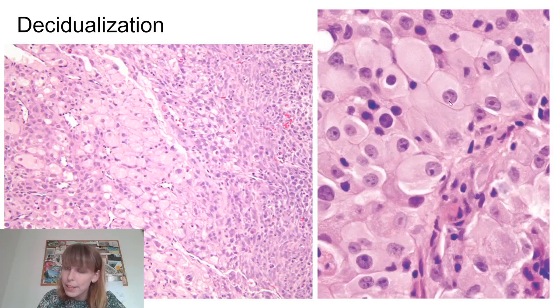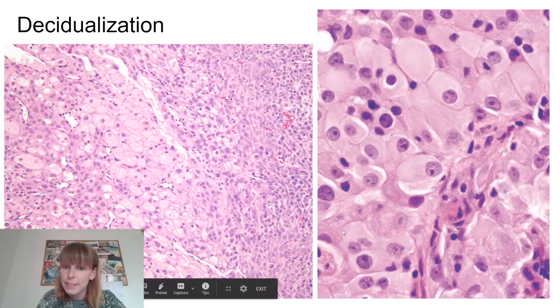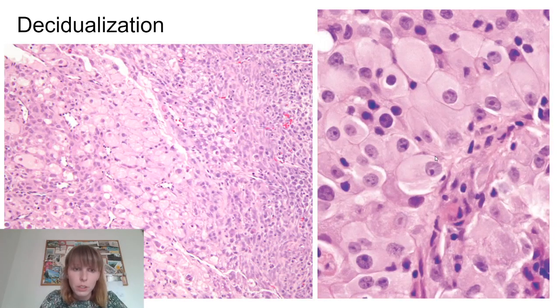They will not be stained, they will wash out during the preparation of the slides, if you remember, white adipose tissue. So here it's not just adipose tissue, it's not just lipids, it's also glycogen. So the cells are swollen like this, they have very big cytoplasm, and so they will be very easy to recognize.